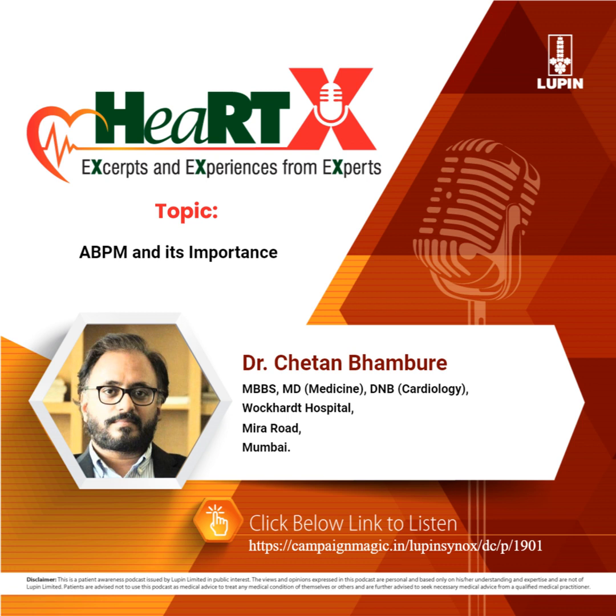Overall, ABPM readings can guide towards the prognosis of underlying organ damage and can be a useful predictor of cardiovascular risk. Therefore, in any patient suspected of hypertension, ABPM or ambulatory blood pressure monitoring is a must.